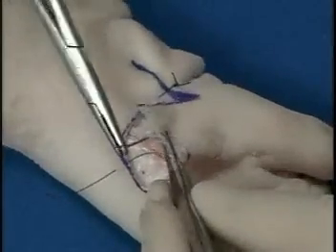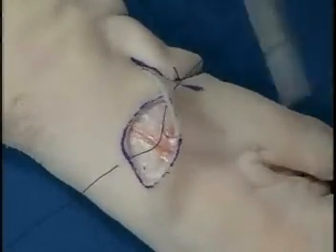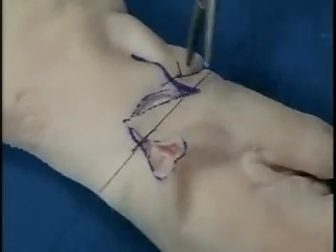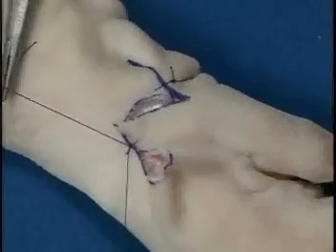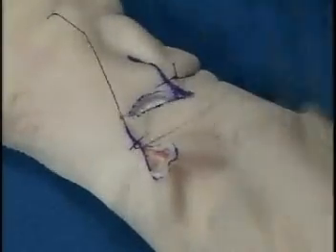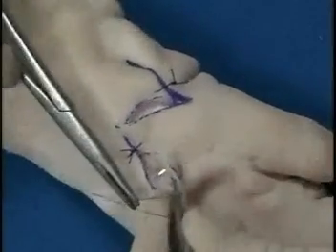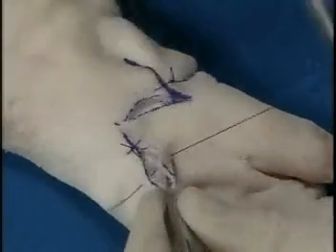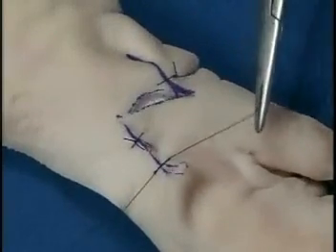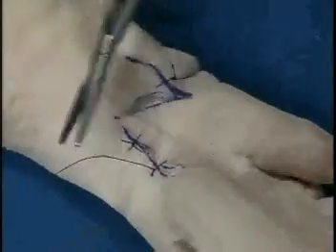Notice this is a triangle being rotated into a circular defect. So we need to be able to trim the excess of that flap so that it fits and will inset nicely into the circular defect. Here we see the dog ear. So we place a suture to close this end of the flap. Placing it in position, we can see the dog ear has now been created. We will remove that by making the back cut and then sewing that into position.